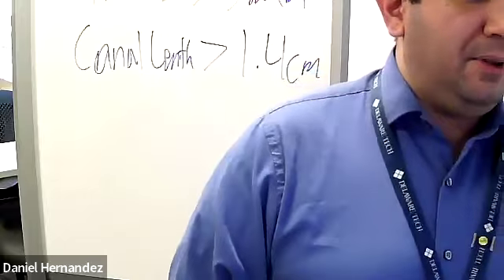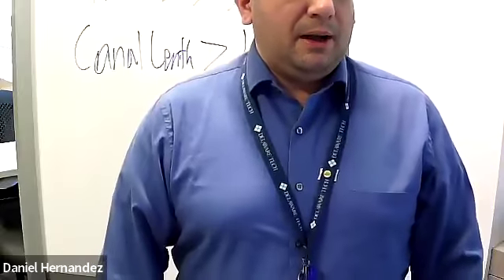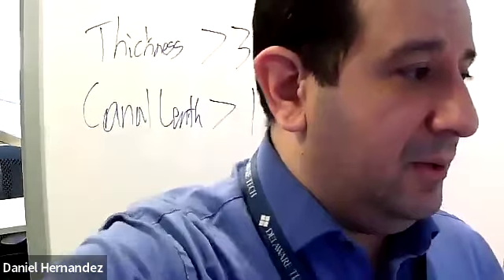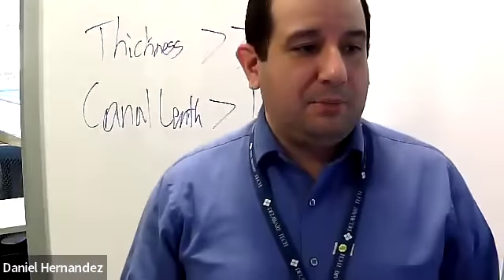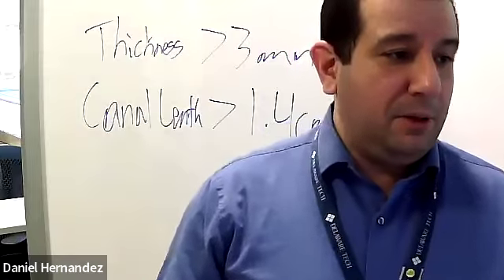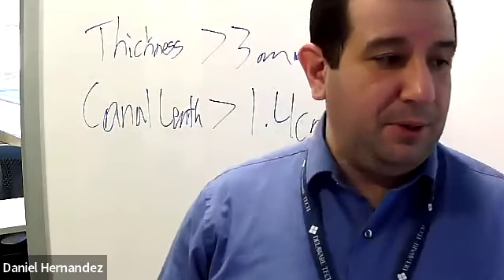So again, if there's not enough residual gastric fluid present, we're going to administer some glucose water in a bottle or syringe. We could potentially use Pedialyte or sometimes breast milk. Pedialyte will have a similar appearance to water as well. However, formula is more echogenic and might occlude a good view.